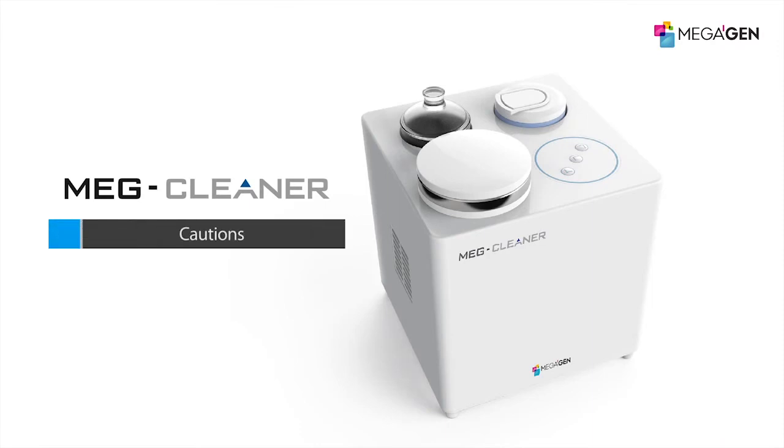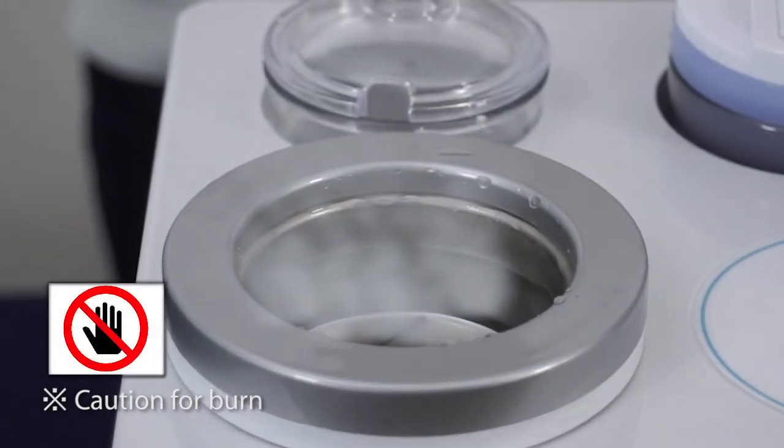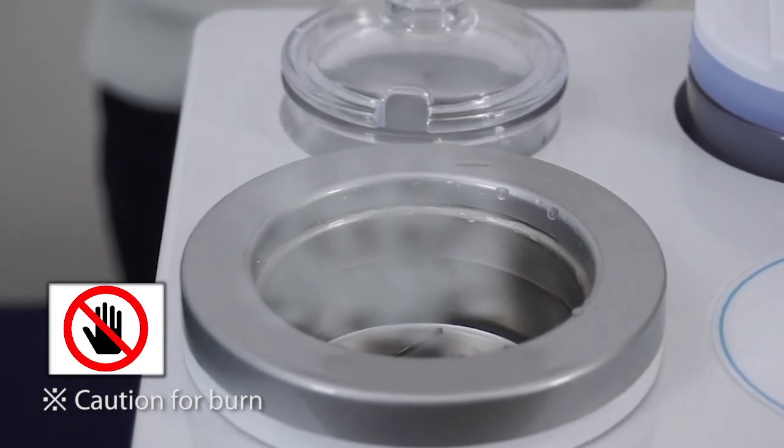Cautions. When soaking is finished, the water temperature can rise up to 60 degrees Celsius. Use plastic tweezers when you pick the tools up, and change the water after it becomes cool.